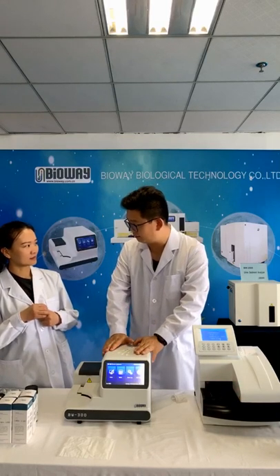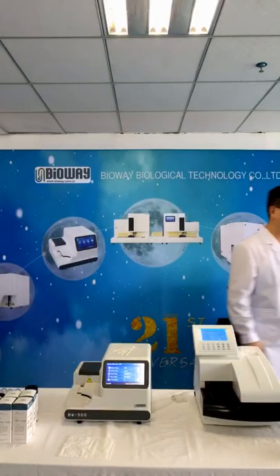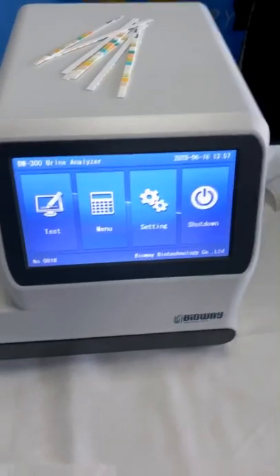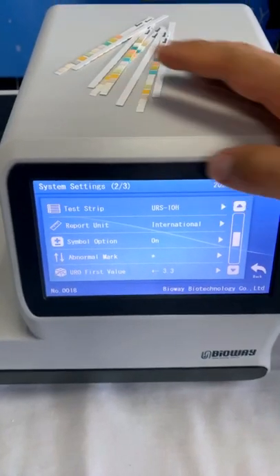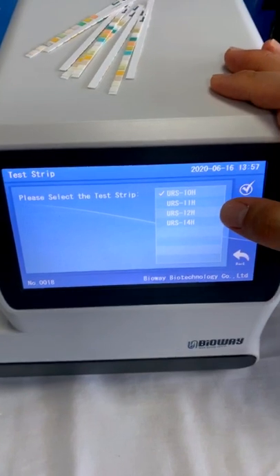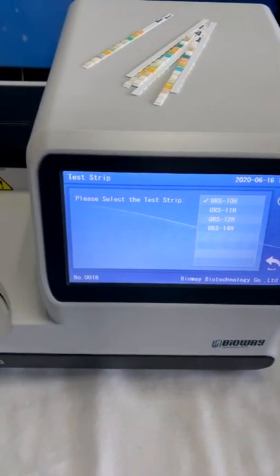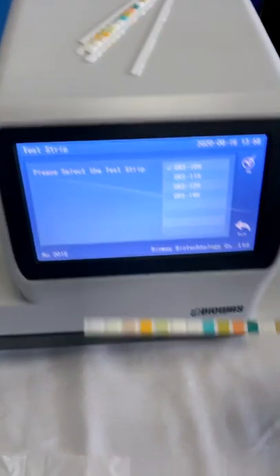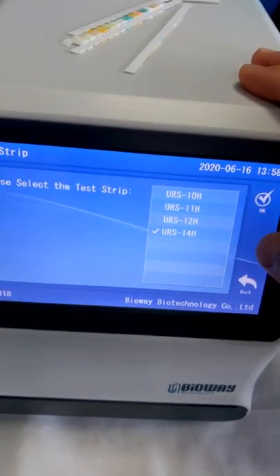Before we test, we have to figure out the configuration of the system. In the menu, in the settings. Okay, this is the home page. Click setting. Please find the test strip. There are different options: we have URS 10H to 14H. This time, I decided to use URS 14H. Just like this, all the test parameters are on this urine strip, so we have to choose URS 14H.